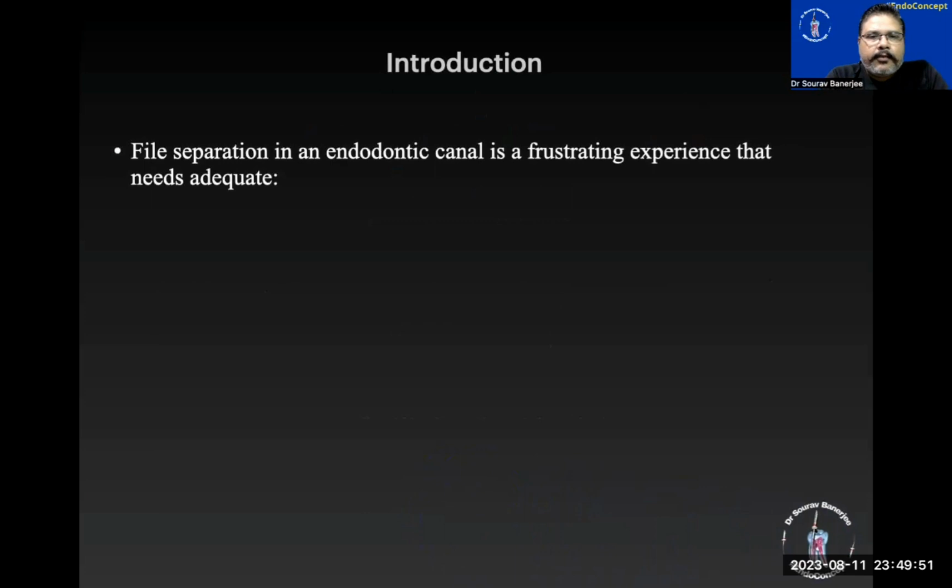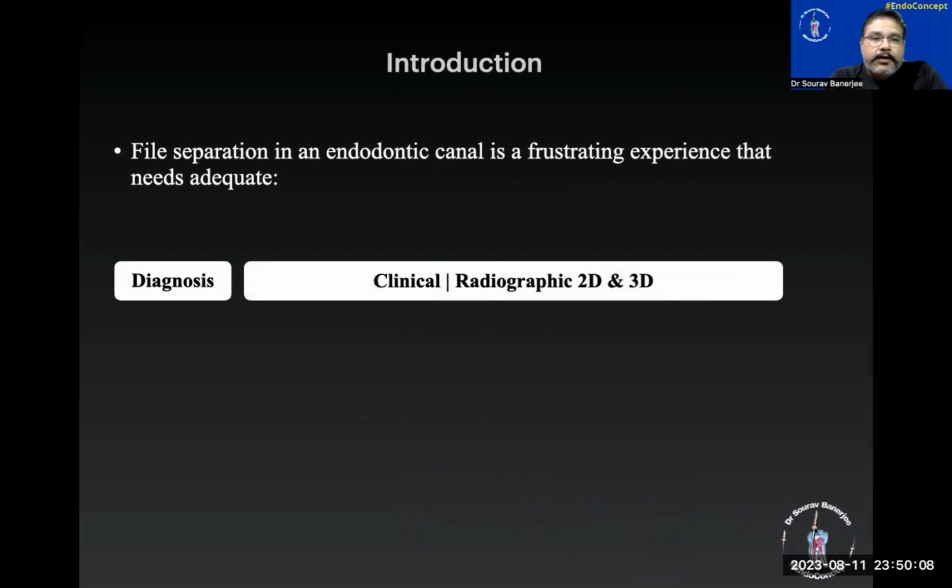So, first of all, it's quite obvious that whenever a file separates in an endodontic canal, it's quite a frustrating experience for all of us, for all the clinicians. The difficulty is, on one part, how to deal with it, and on the other part, how to explain it to the patients. We will be concentrating on the other aspect, how to clinically manage this kind of situation, which we are going to follow up in this particular case.